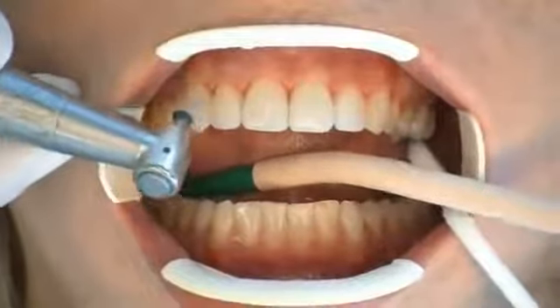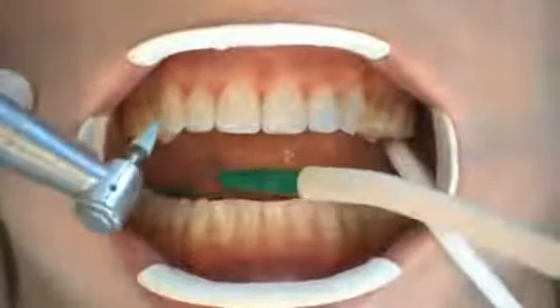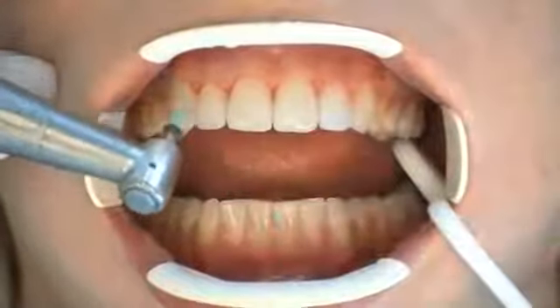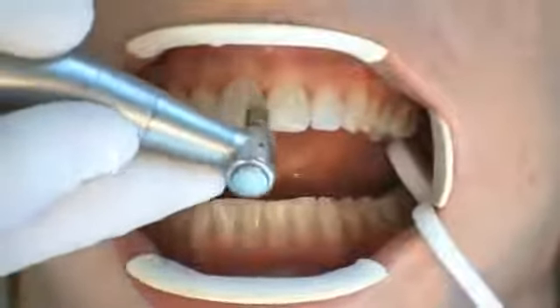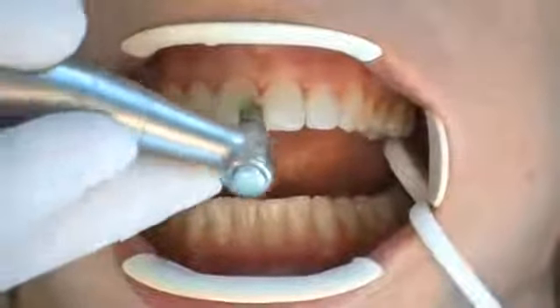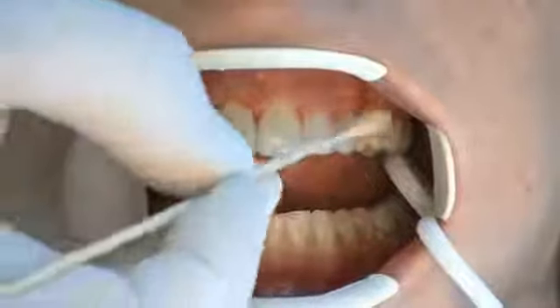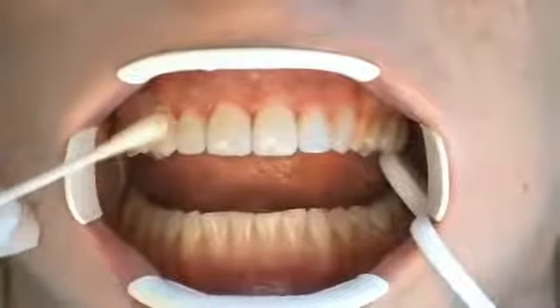Tapered polishers are used to accentuate mamelons or to smooth out structures. Silicon carbide-coated high-rpm brushes operating in a dry environment with air cooling are the best means of achieving an optimum high gloss. The application of fluoride prevents the deposition of colors in freshly treated areas of enamel.